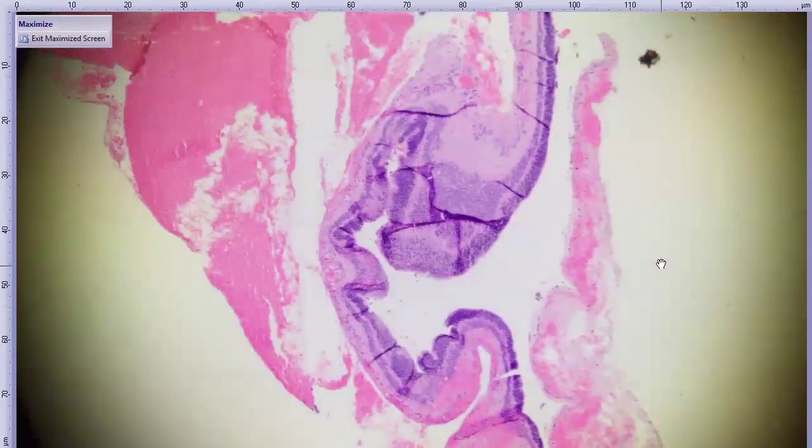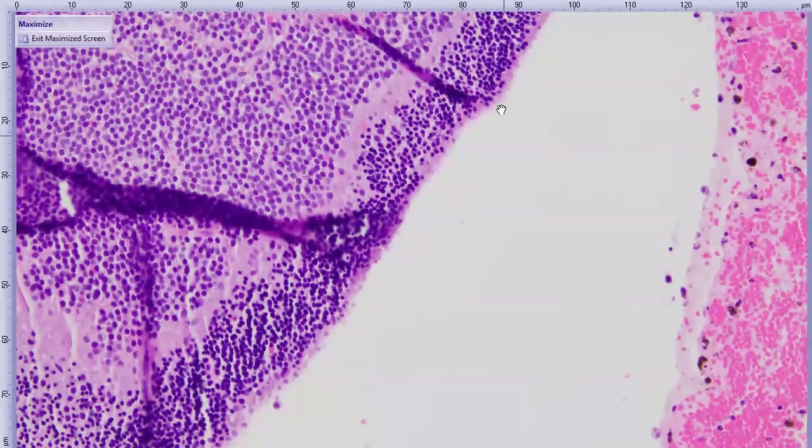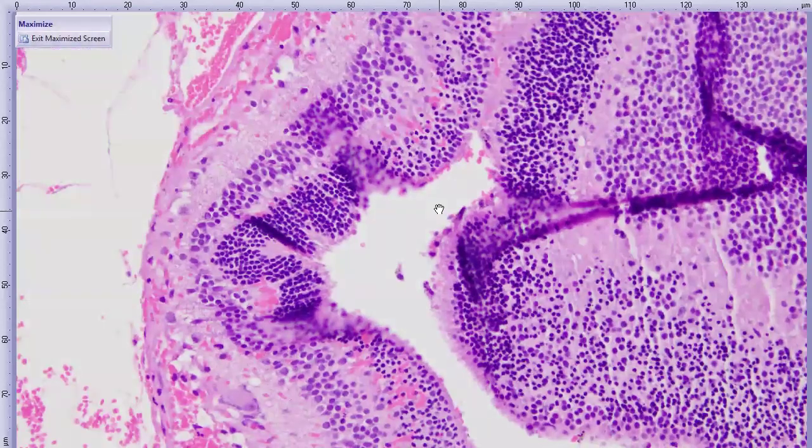When we look back over in this other area, this was a couple of days between the unwitnessed trauma and the enucleation. So what we do have here is shortening of the photoreceptor inner and outer segments. So we've shortened the frilly frills, the pink things, which are actually responsible for where all the phototransduction takes place, and that occurs relatively quickly after retinal detachment.